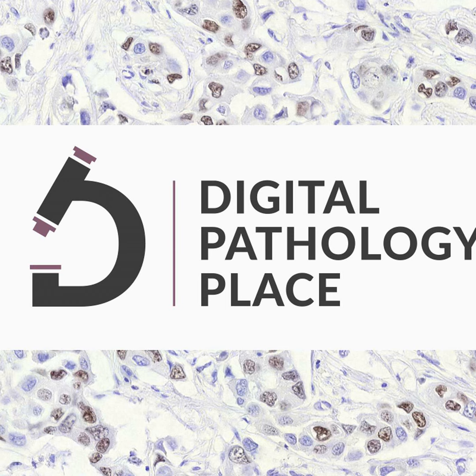A question here. This is true for the supervised as well, right? Even if we annotate the full slide, the network only learns fragments. Exactly. Yes. So if you train a patch-based network, so based on tiles from the image, you know that the network can never learn the context of this patch. So for example, in the lymph nodes, the anatomical structure of a lymph node is completely unknown to the network and also cannot leverage this knowledge to make better predictions.